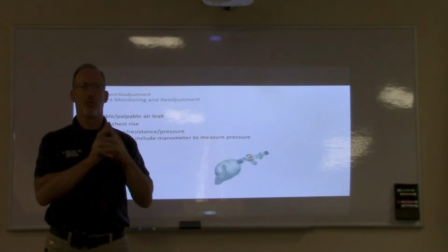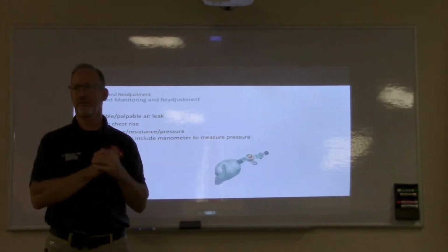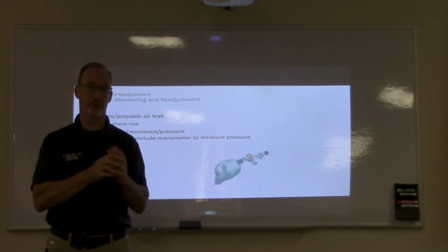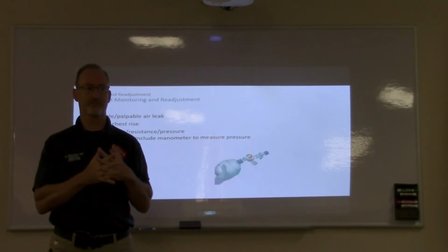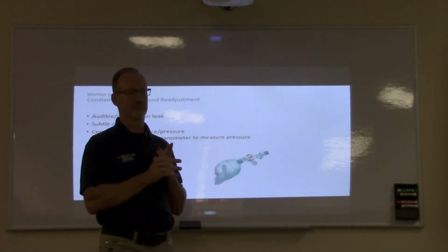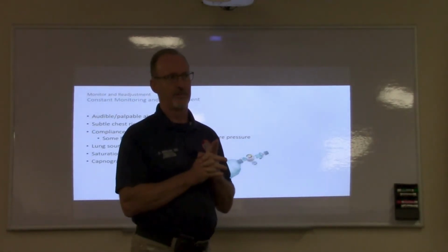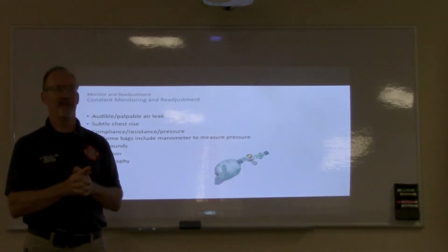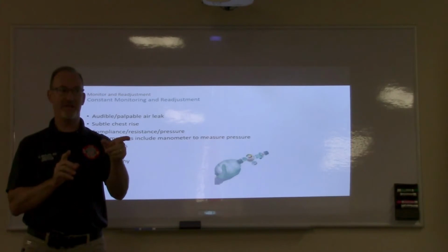So why do we run some codes with a non-rebreather? We should be running a lot of our codes with only a non-rebreather. The initial idea should be to just give them oxygen and start going that way, and then free up hands to start doing other things. So interestingly, it has nothing to do with the number of hands you have. It's an added benefit if you don't have a lot of hands, but that's not the intention.